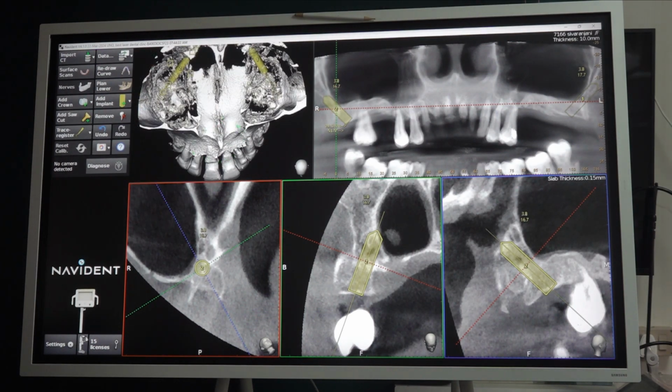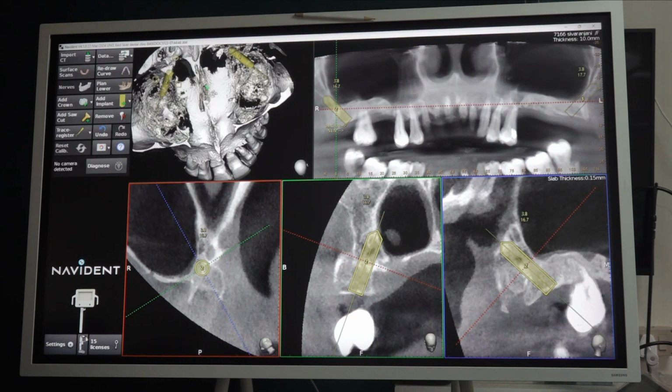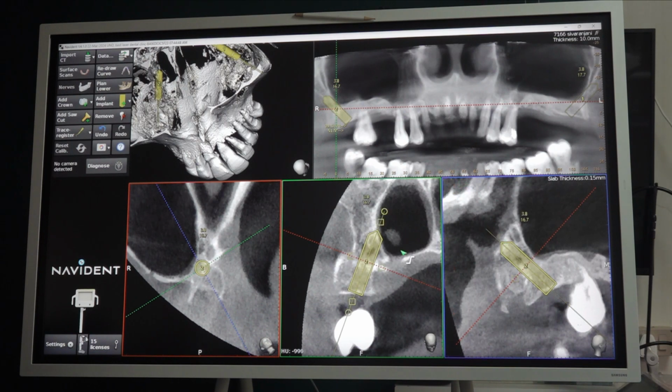We think that the nose exists only in the anterior part, but the nasal cavity starts from the anterior and goes till the end of the hard palate. That is why, if we go too much into here, the patient reports swallowing difficulty. One patient was telling of swallowing difficulty and severe secretion. After we removed the pterygoid implant, that was it. Very, very rarely it happens, only once.